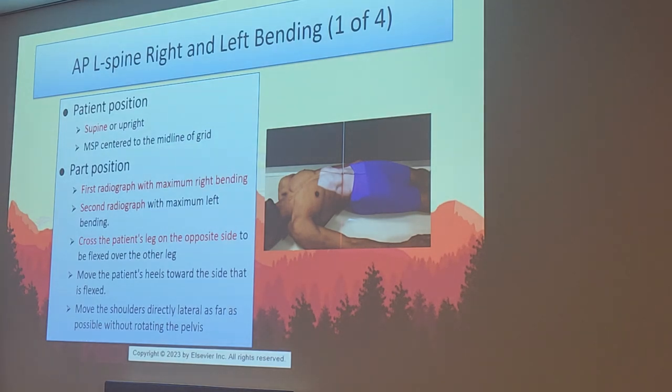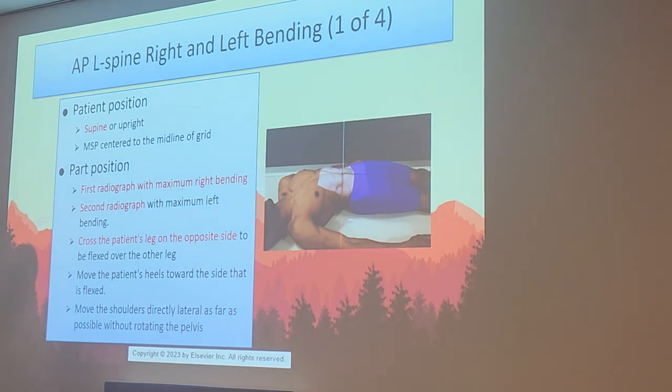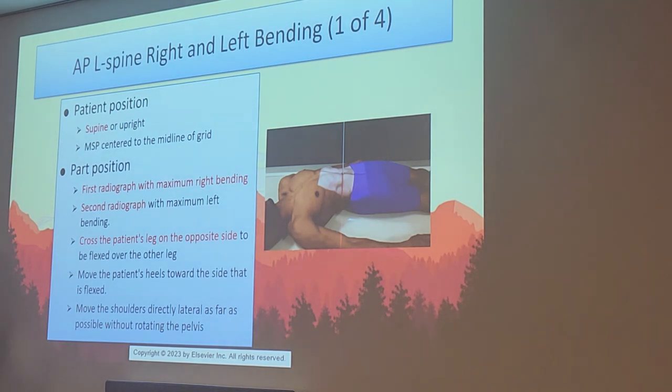Now we're gonna talk about two little specialized views here, guys. This is what we call the AP L-spine right and left bending views. This is not flexion extension. This is a very rare x-ray. We don't see this very often. Typically, they're gonna do this when they're checking scoliosis a little bit further for degree of the curvature of the spine. So this is our AP left and right bending views. We're really gonna bend the torso. So not flexion extension, this is bending. Flexion extension is coming up, it's a different one. You didn't do these in lab. This is a specialized view. This is very rare.